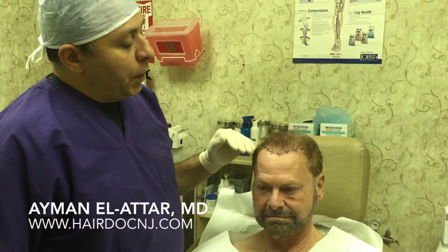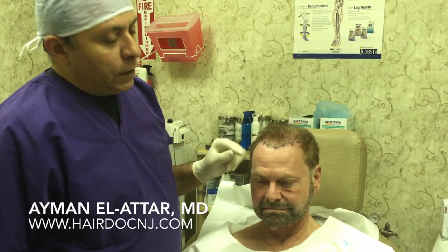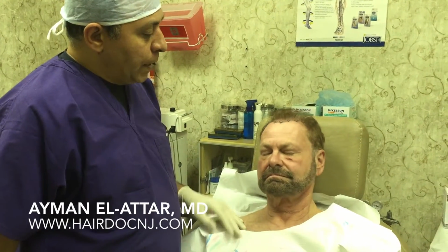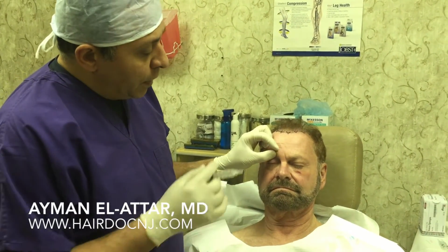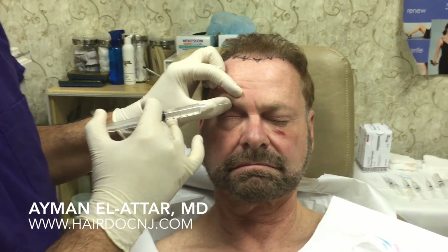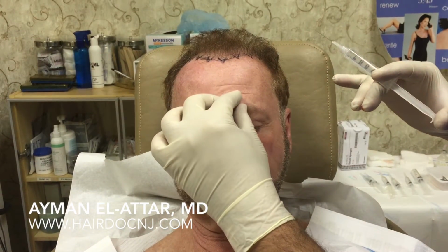As we try to numb the recipient area, there are 2 techniques that I like to use. The first technique is supraorbital supratrochlear blockage, and we ask the patient to relax back. We just feel the foramen in the supraorbital rim, and right where the foramen is, I'm going to place about 0.5 cc's of the lidocaine with epinephrine 2%, and just let it sit for a few minutes. Usually it takes up to 90 seconds for this to take effect, and that should start numbing the whole entire area here.